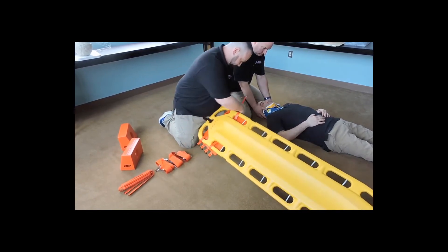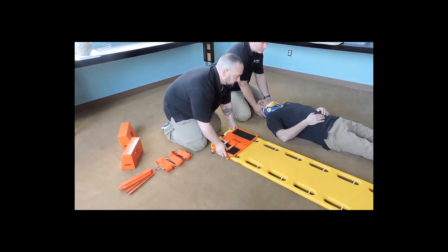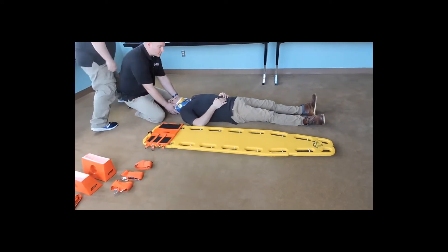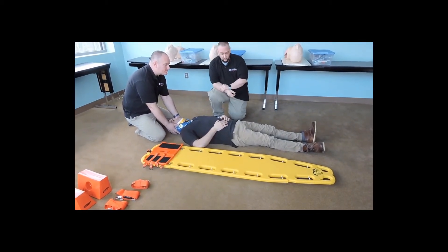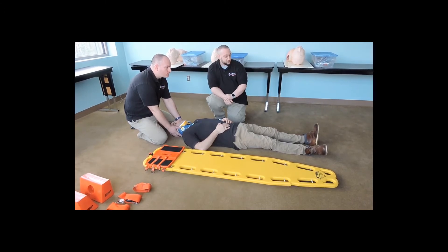I'm going to work with my partner to line this up with my patient. So at this time we're going to move the patient. Ideally, how many people would you like to do the log roll? Ideally we like three — we want to maintain immobilization, go on the headman's count, with at least two on the side of the patient. I would have one up at the chest to get the shoulder and the pelvis, with interlocking arms at the pelvis and lower legs for a secure and unified movement toward us. We would place our long board into position and on the headman's count log roll the patient onto the board, making sure they are properly positioned.